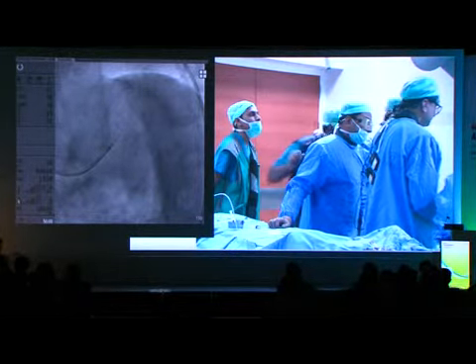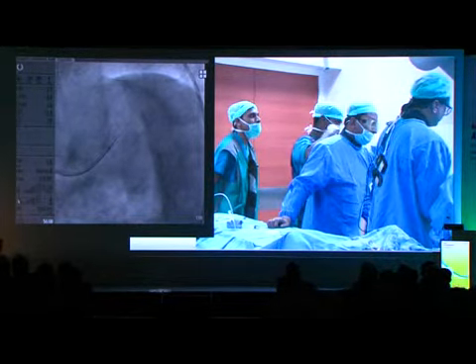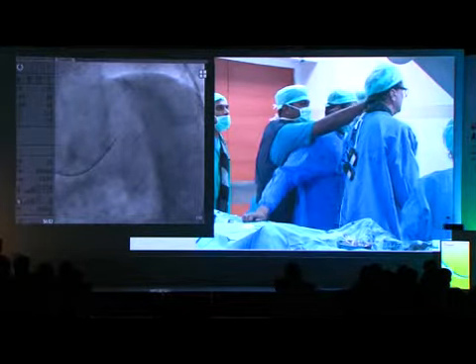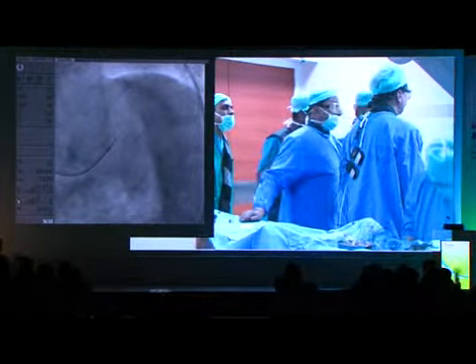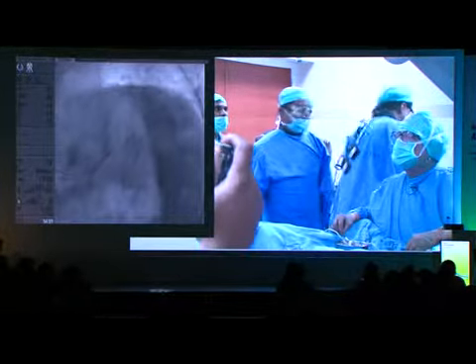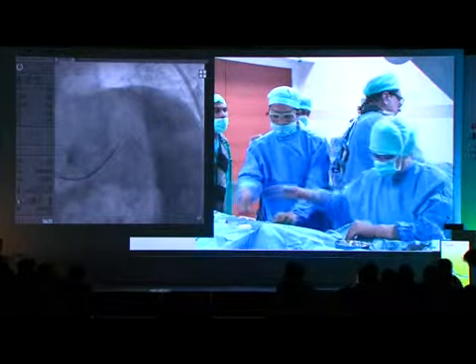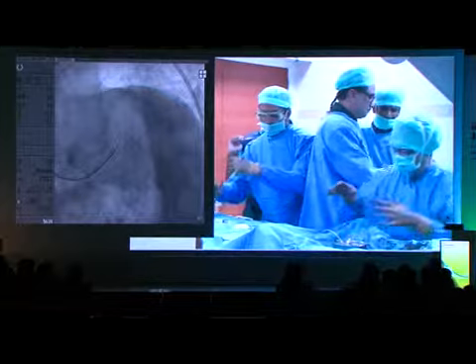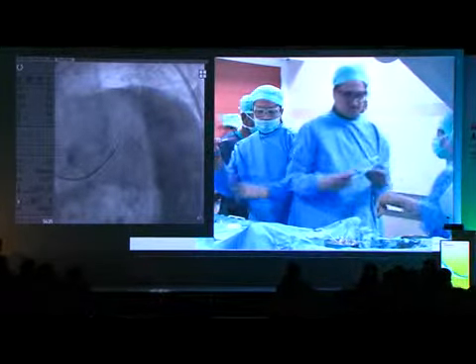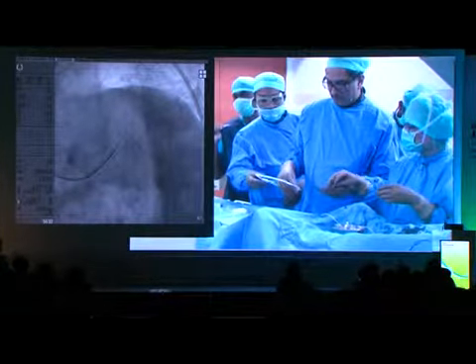Conquest Pro is too tough. You want a Shinobi? That should work. Yeah, give a Shinobi, that will work. Okay, so I leave the microcatheter there. So the second choice is a Shinobi.